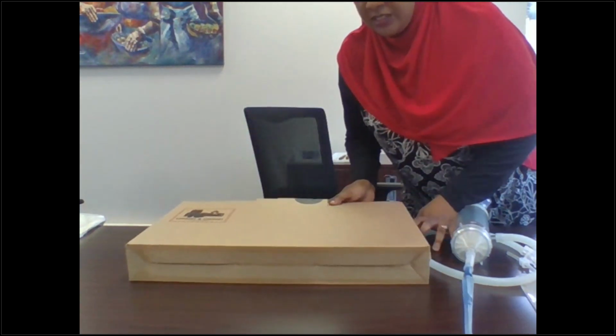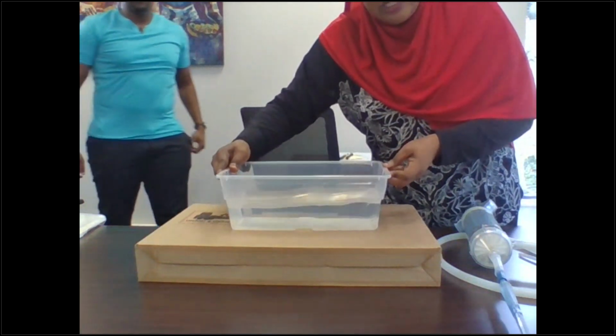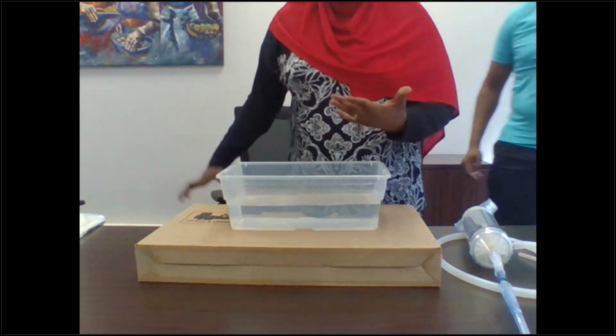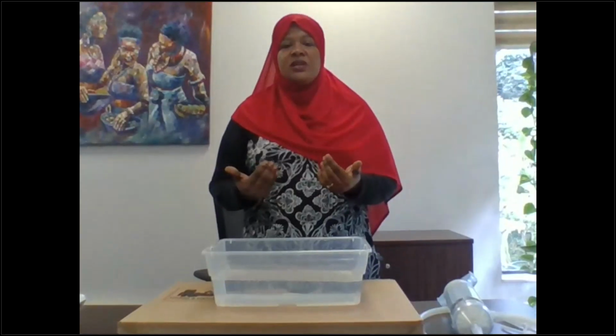So I will put this box just to elevate my surgical site, and we assume this is our patient with blood inside to operate on. I said we need people who are sterile and one who is not. 2 people need to be sterile, and 1 person doesn't really need to be sterile because they will be operating the side that is not closest to the patient. Sterility is really important during a surgical procedure. So I will take the role of the scrub nurse, and I will request one of my colleagues to take the role of the surgeon, and one of them will take the role of the anesthesiologist.